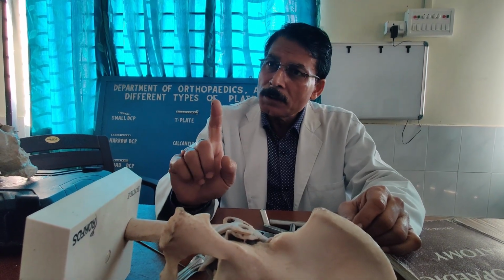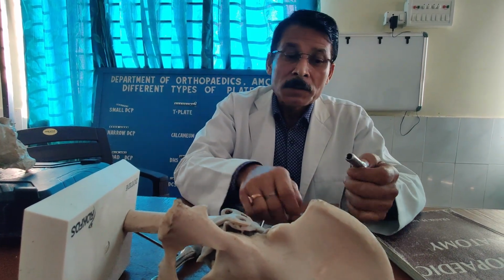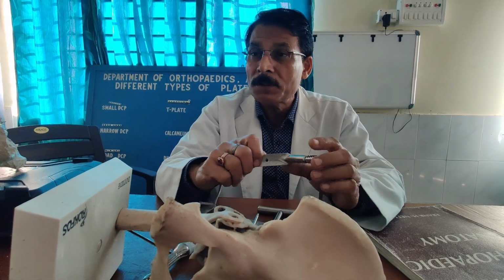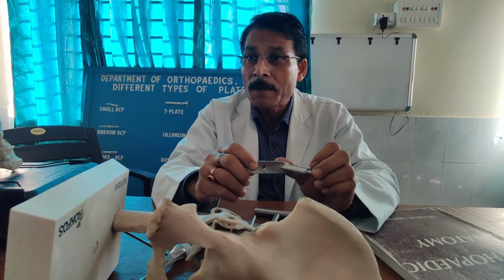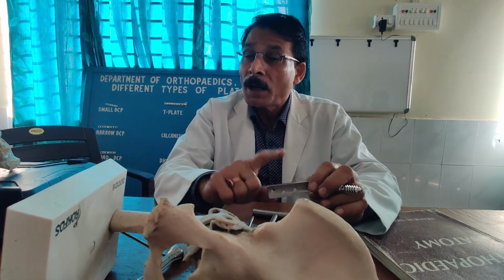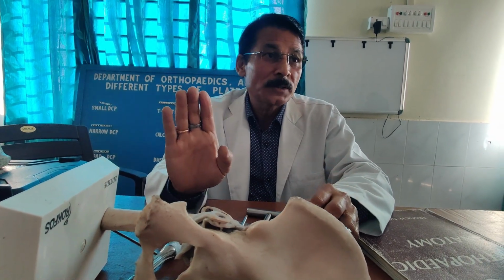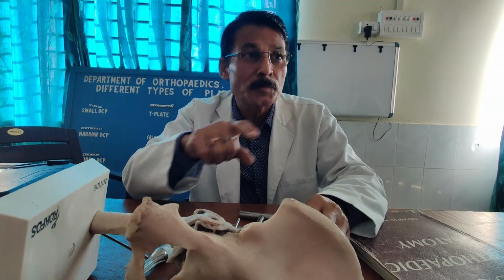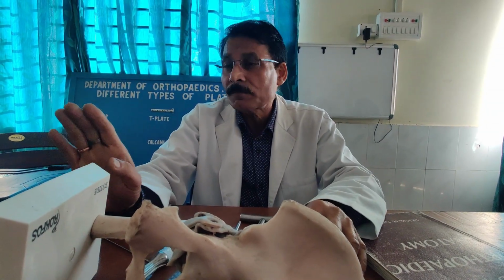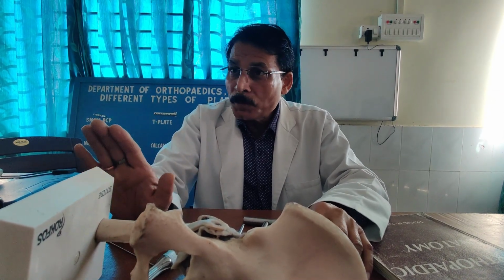So you see, the plate is a fixed one. This device is very fixed. So essentially to place a fixed device, you do not have the variability here. So essentially you are supposed to have a good reduction before putting it. Without getting the reduction, you cannot do it. One point is you must have a very good reduction, and from the reduction point of view also one can know what is stable and unstable by Evans classification. That is one. Reduction is there, everything is fine.